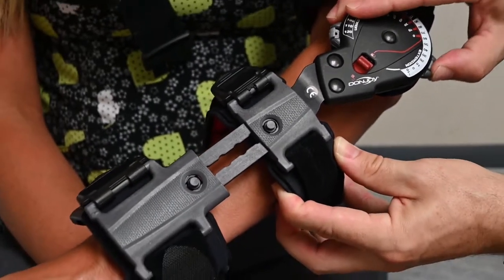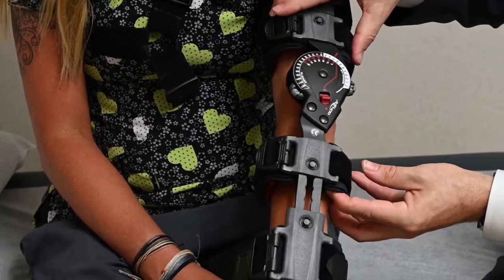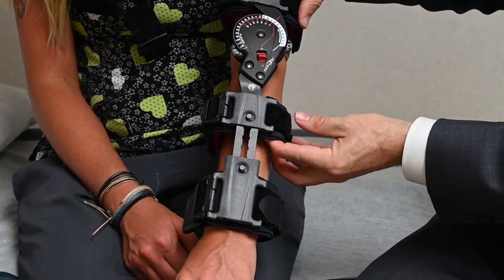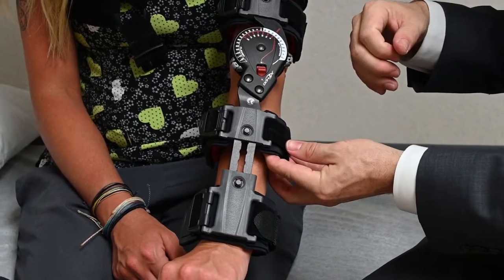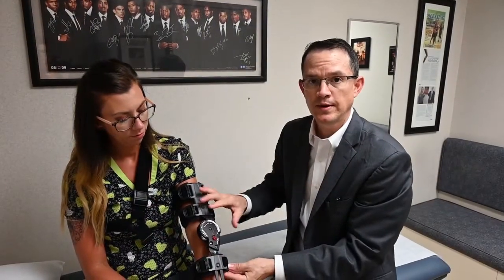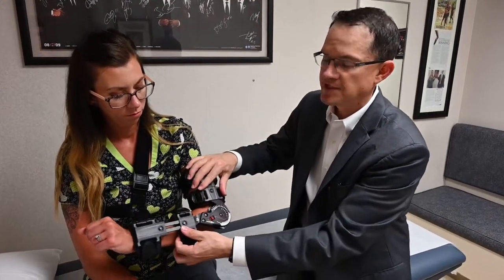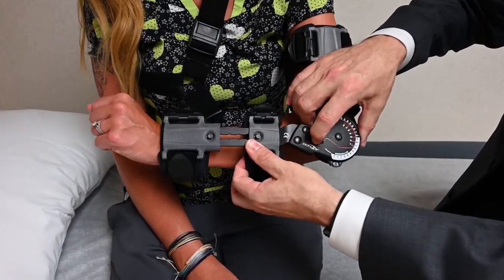Once we get the dial all the way to zero, it will then allow the arm to come all the way out straight. In this manner, we are controlling the speed at which we stretch your biceps repair back out to full extension. When not performing your range of motion exercises, I encourage patients to place the elbow back up into the 90 degree position and lock the brace in place.